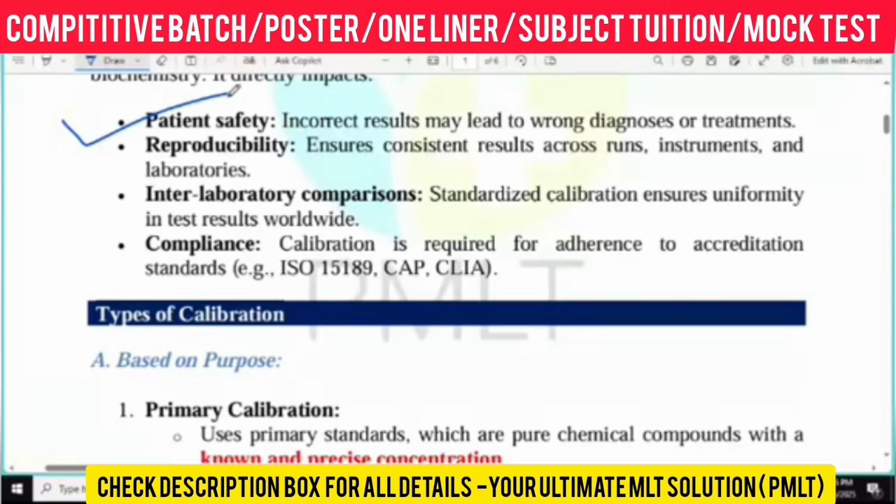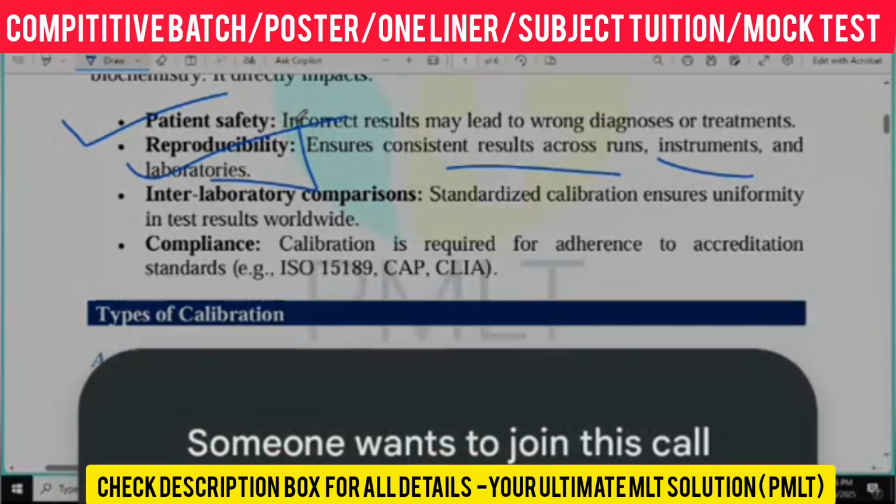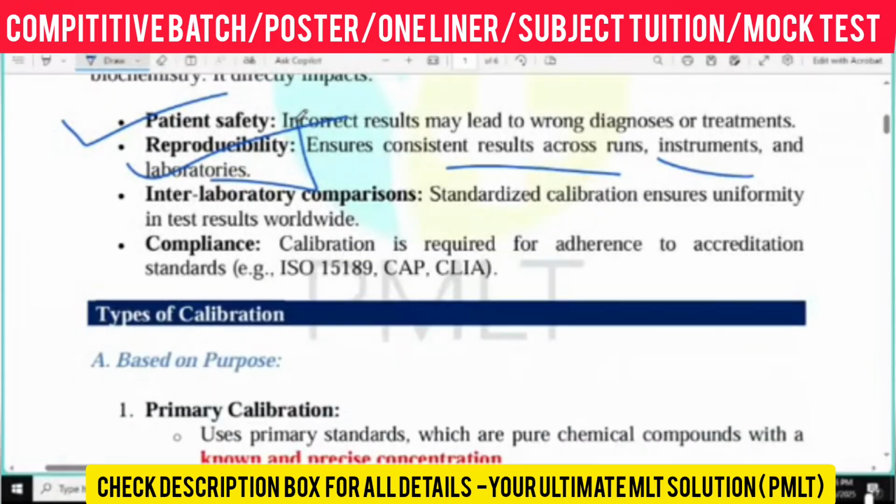The second thing is reproducibility. It ensures constant results across instruments and laboratories. It means that within a certain time, with the proper instrument, we get the proper result. If you are not running the calibration properly, you will not get reproducibility.